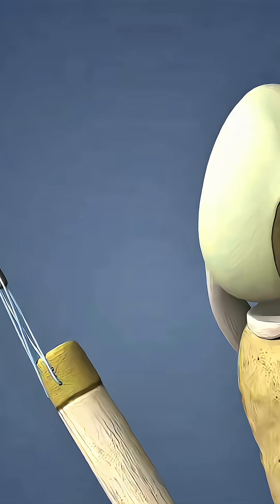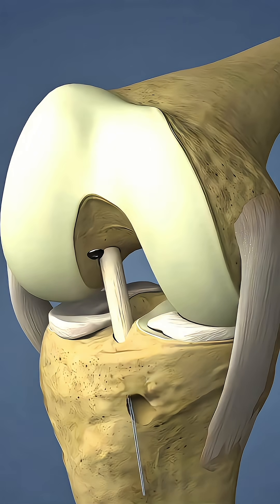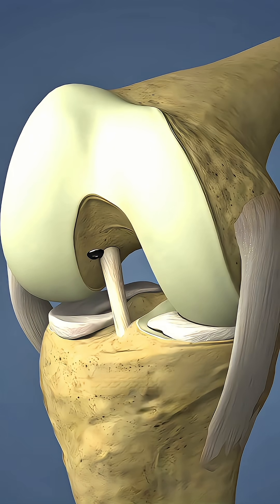Ever wondered how doctors repair a torn ACL and bring back knee stability? Watch till the end to see how ACL reconstruction is done and follow us for more surgical knowledge.